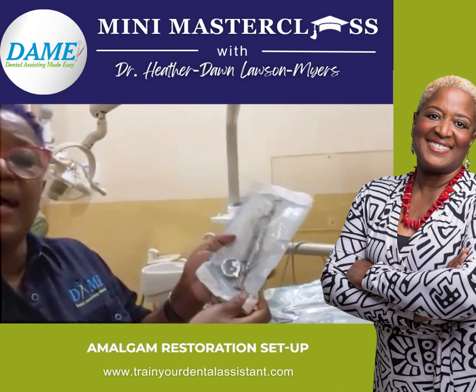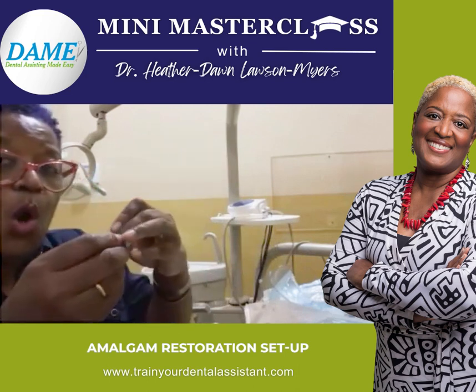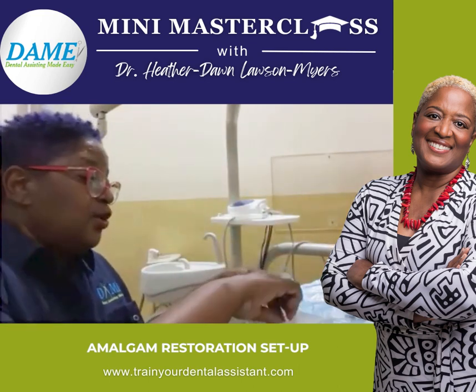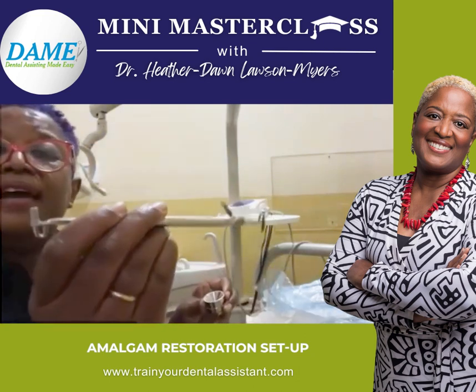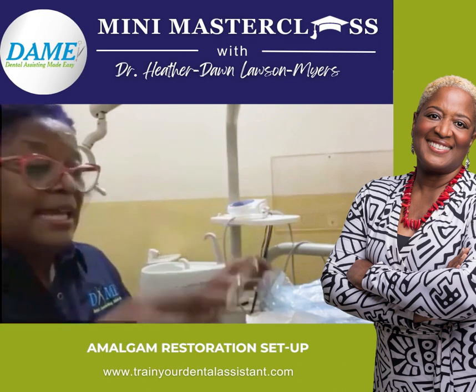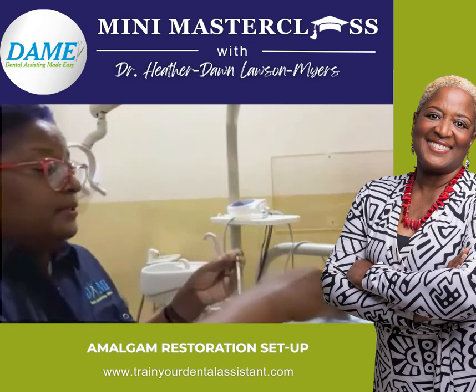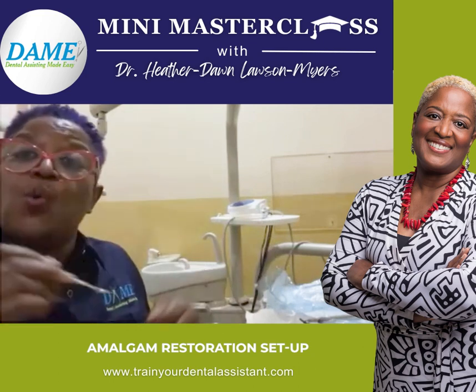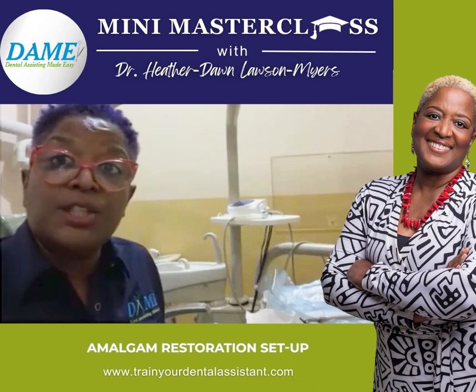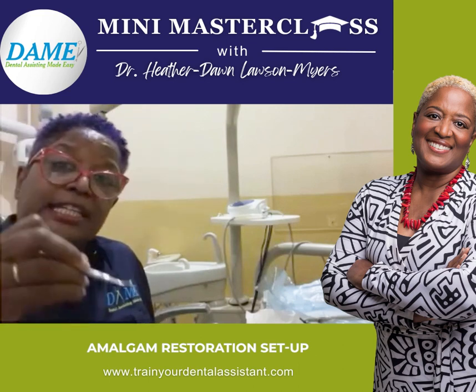And then I'm going to take out these amalgam instruments to show you. Once you have shaken this up, you open it out and pour the contents into this amalgam well, okay? And then we use the amalgam carrier to pick up the stuff we put in the well. This is what you do as the assistant. Hand it to the doctor, and the doctor squeezes that stuff out into the tooth and then has to pack it in. So whereas with the composite, we put it in and use the light to cure it, the amalgam does not use a light. We use this packing instrument to secure it in that tooth.